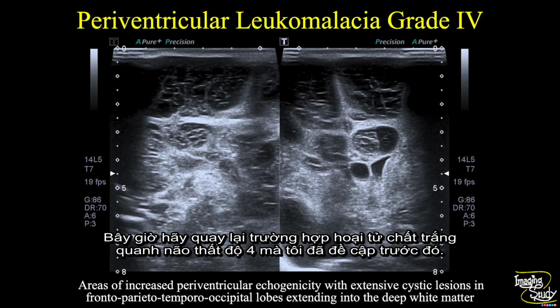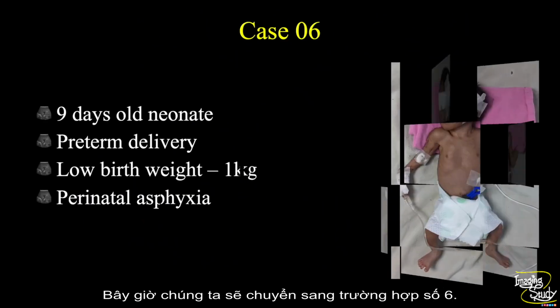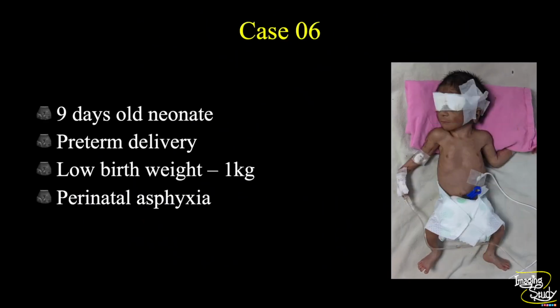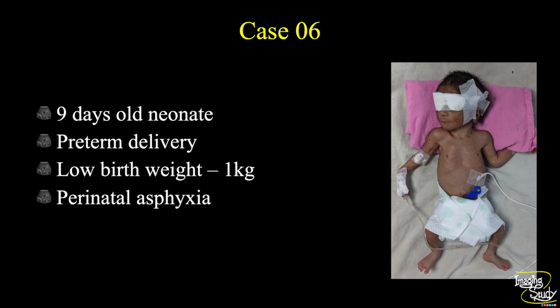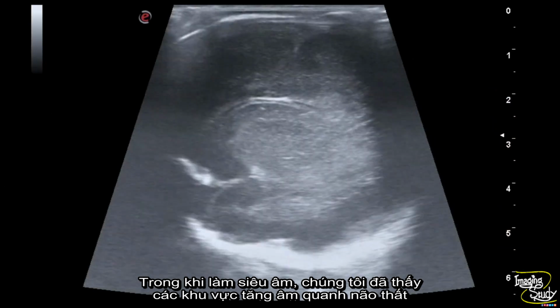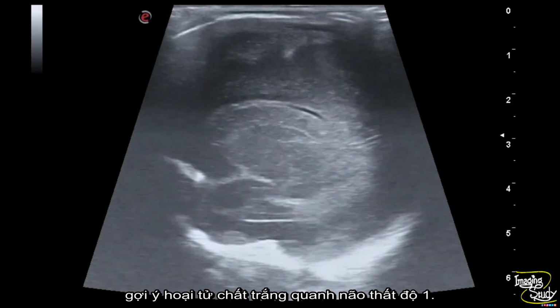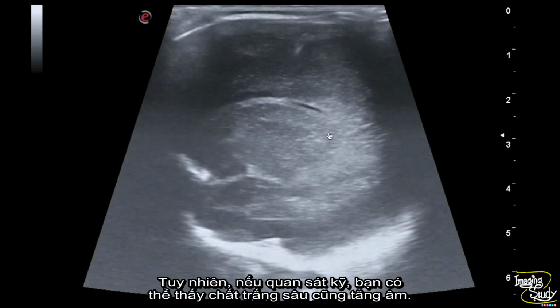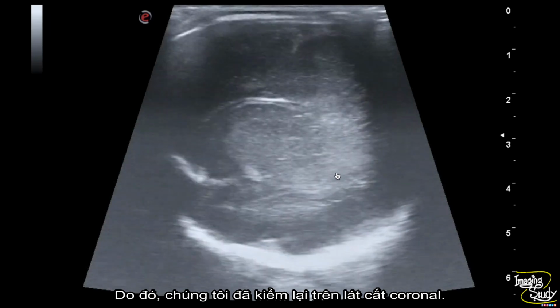Now again the grade 4 periventricular leukomalacia, which we have already covered in this session. Now let's jump into our today's case number 6. This is a 9 days old neonate with preterm delivery, low birth weight of 1 kg and perinatal asphyxia. During our ultrasound scan, we have seen the periventricular echogenicities are increased, indicating the periventricular leukomalacia grade 1. But if you check carefully, this is the part of deep white matter which is also echogenic. So we have checked on coronal section.